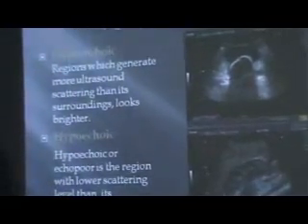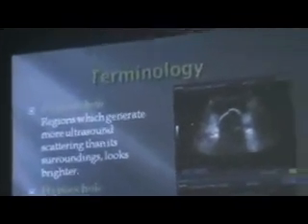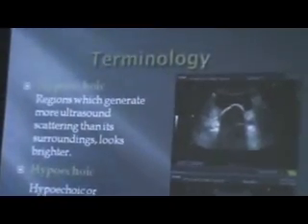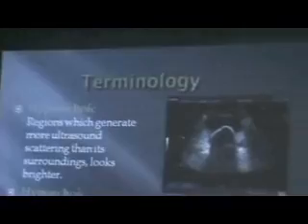Now there are various terms which we should be familiar with before doing the ultrasound examination. Echogenicity means brightness. When I say it is hyperechoic, it means that it is brighter, because it scatters the ultrasound waves more than the adjacent tissue, so it looks brighter.